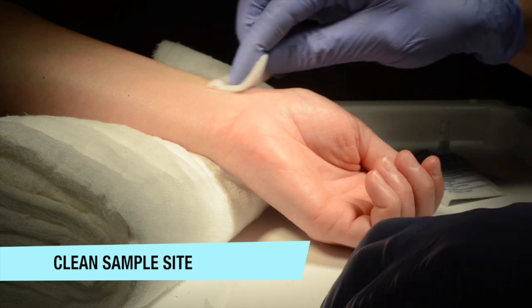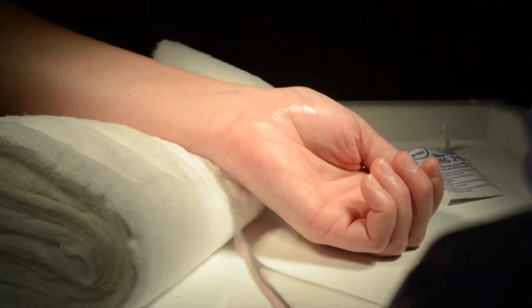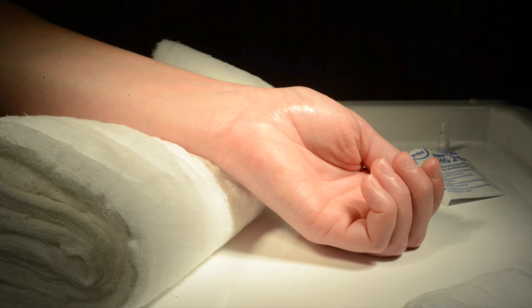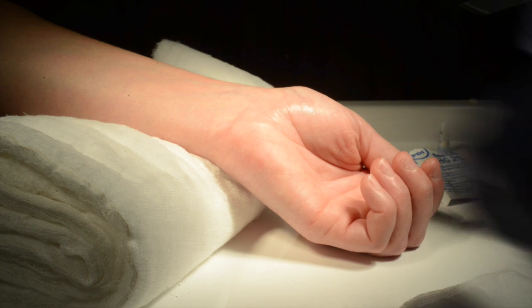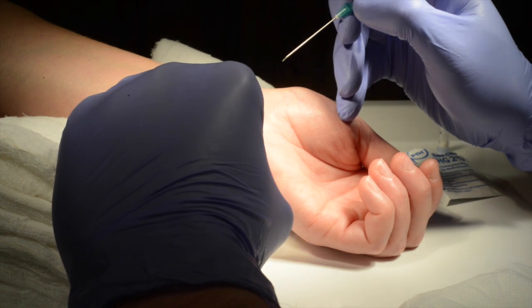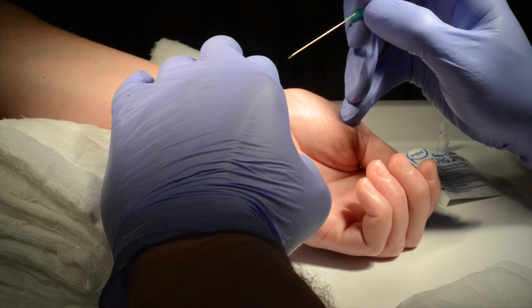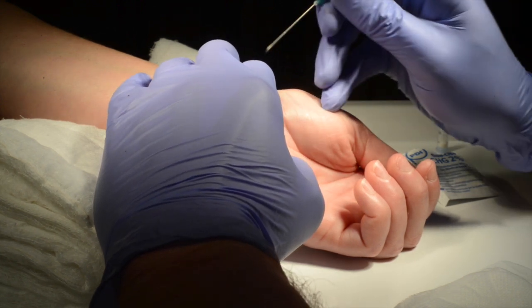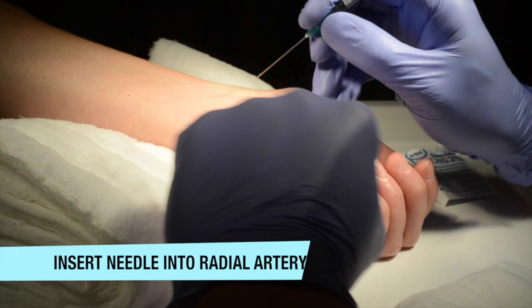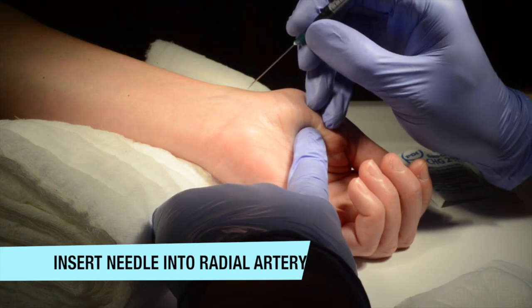Ensure that the site is clean and the wrist is at a comfortable angle with roughly 20-30 degrees of extension at the wrist. To aid in this procedure, ensure that your right hand is on a stable platform and use your left finger to tense the skin.